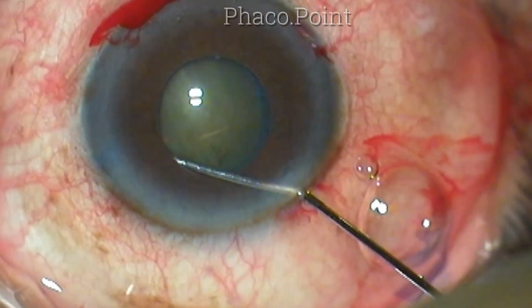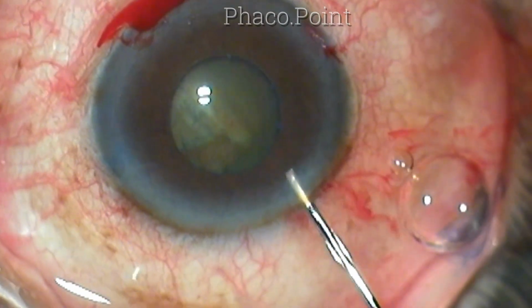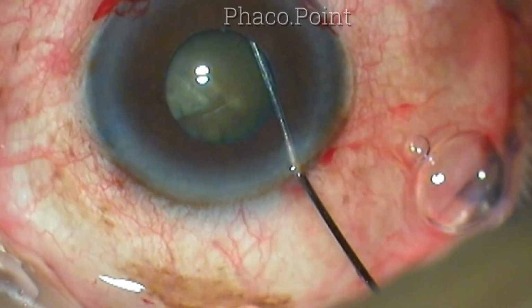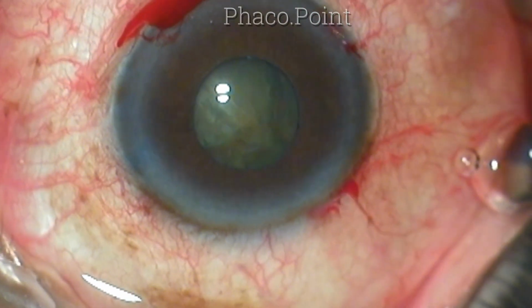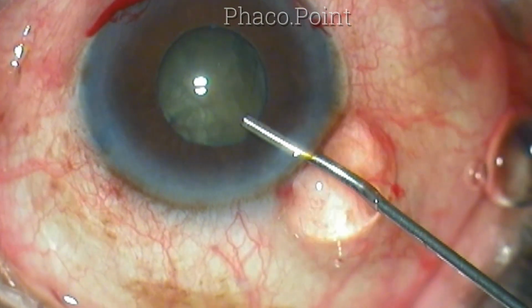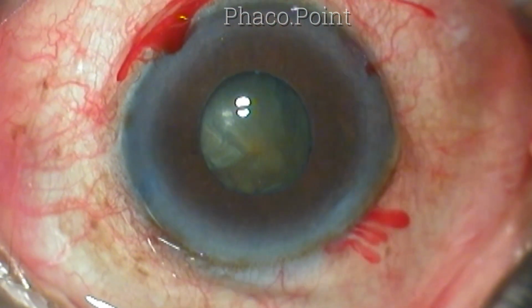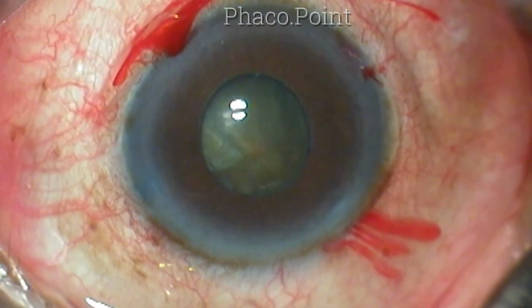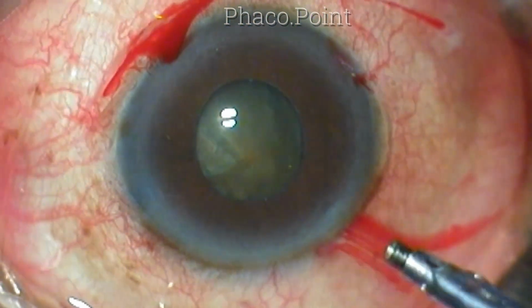Just a small amount of fluid is injected to effect the cortical cleavage hydrodissection. Just 0.1 to 0.2 ml of fluid is enough to effect the cortical cleavage hydrodissection. This is a very important step because if you do not perform this step correctly, then you will definitely be imparting zonular stress, and a failure to rotate will also impair or impede the progress of phacoemulsification.